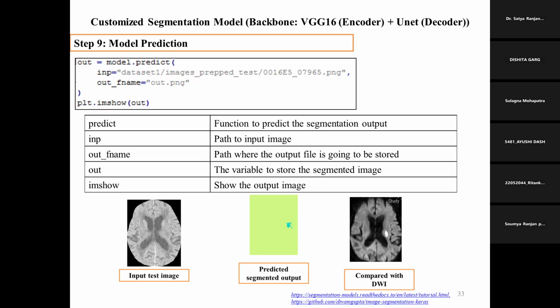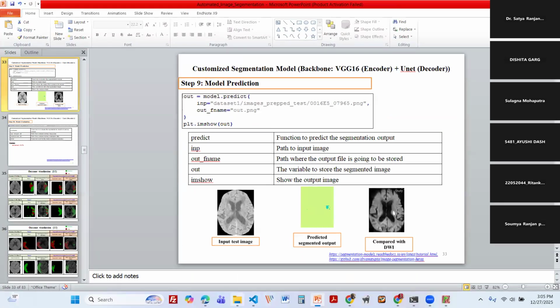So segmentation is actually a little easy, but finding the right model and the right backbone is always challenging in segmentation, especially in 2D segmentation, because there are two parts, encoder and decoder. Whether UNet VGG16 will work better, or UNet EfficientNet, or PSPNet VGG16 always works better, to get the perfect combination we need to do several rounds of experiments. This Keras segmentation is for beginners like you.